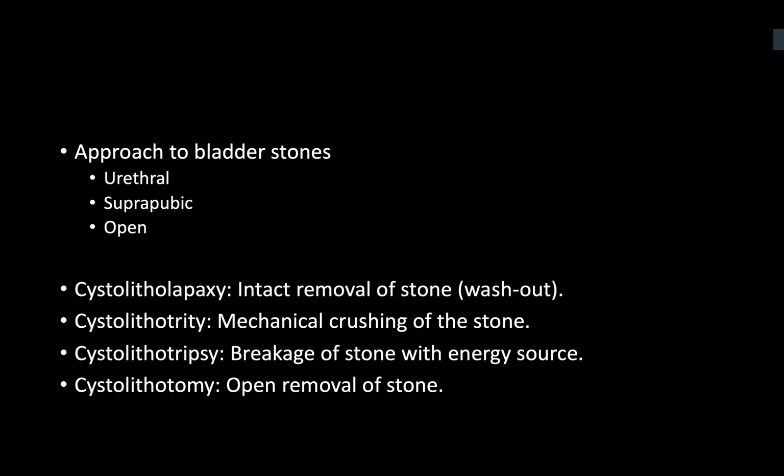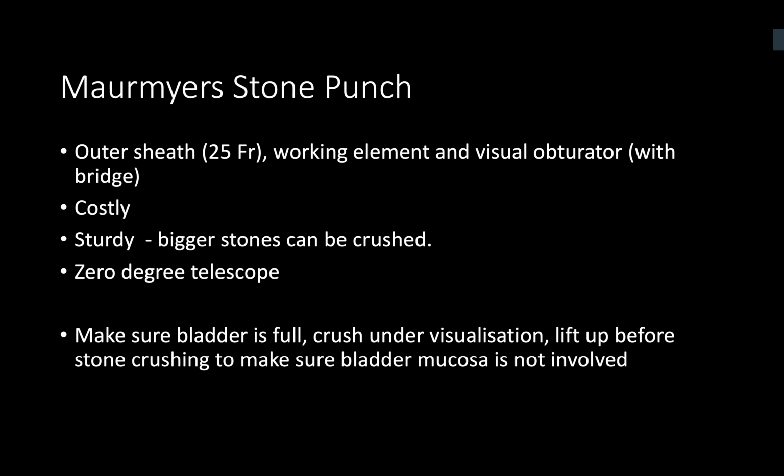Okay, coming to the mechanical cystolithotrite, which device do you use in your practice? Are you talking, sorry, in terms of the bladder stone mechanical crushing? In terms of mechanical crushing, in my practice I use the stone crusher, which consists of inserting this through a specialized resectoscope of up to 26 French. It involves grabbing the stone away from the bladder mucosa, crushing it between the jaw and the tip of the scope, and then performing this repeated times and then evacuating the stone fragments through the sheath of the scope.